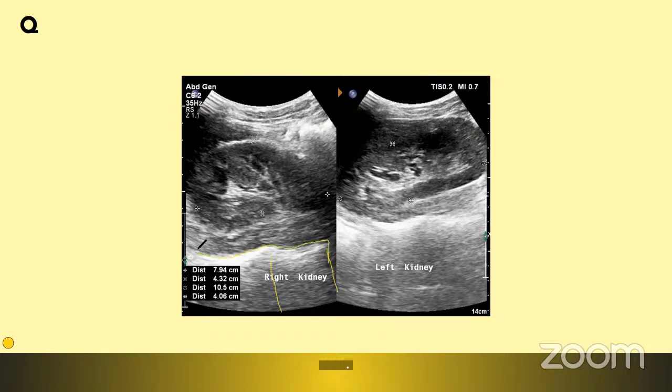this part, right? This is more hyperechoic. As we discussed earlier, there is a lot of propagation of these pulses. Still, I'm able to see something. These are just probe ultrasound pulses. However, we did not see much of the hyperechoic regions in the kidney, and also it doesn't even make sense, right?